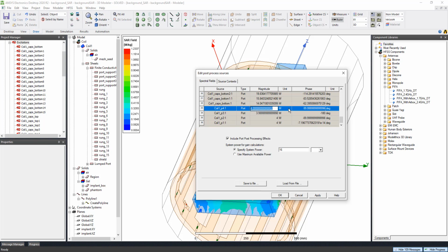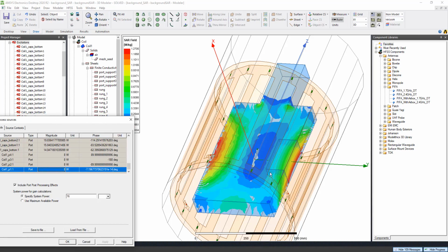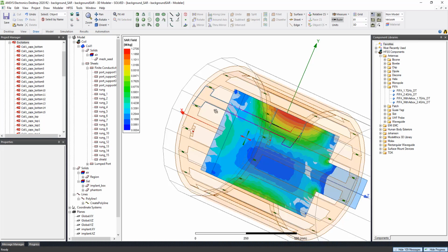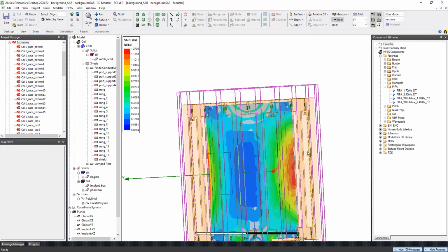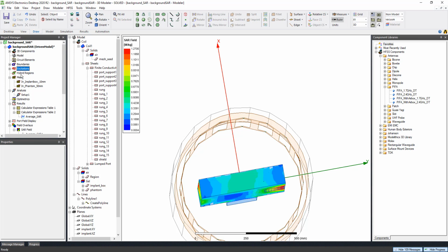Let's say we change it to 8 watts, 8 watts, 8 watts, 8 watts. Apply. Then we will have different SAR values. So you can adjust the power input for your system in this case. So the total power in this case is 32 watts. It takes a little bit of time. Now the SAR view is looking a little bit different.